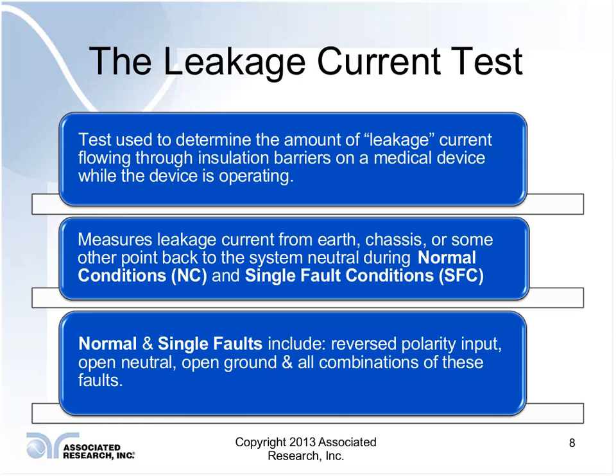Obviously, we're using the conductors to tell the electricity where we want it to go, and we're using the insulation as a barrier to protect us. Now, no matter what, there's always minuscule amounts of current flowing through insulation. We want to know how much that is, and that is the point of this test.